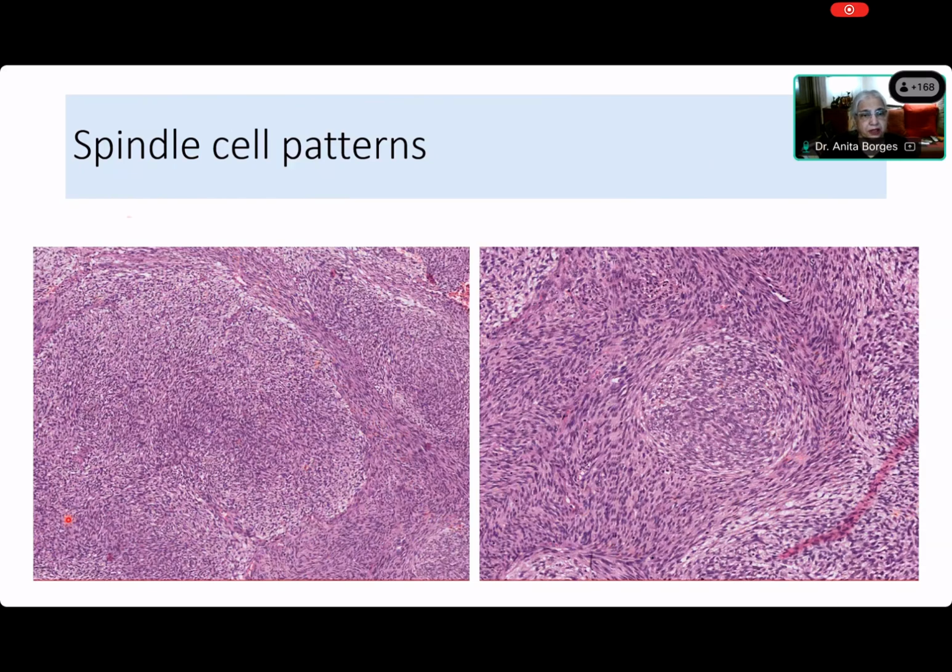Priyamada, what about this huge big thing here? What about all the rest of this? Are they spindle cells? Ma'am, these look like spindle cells only, ma'am. A herringbone pattern is also there, I think. Herringbone. Where is the herringbone? You see a spine and you see things going off at an angle? I don't think so. It's a whorl. Okay, so you have identified that there are fascicles, and then you see some things which are not.